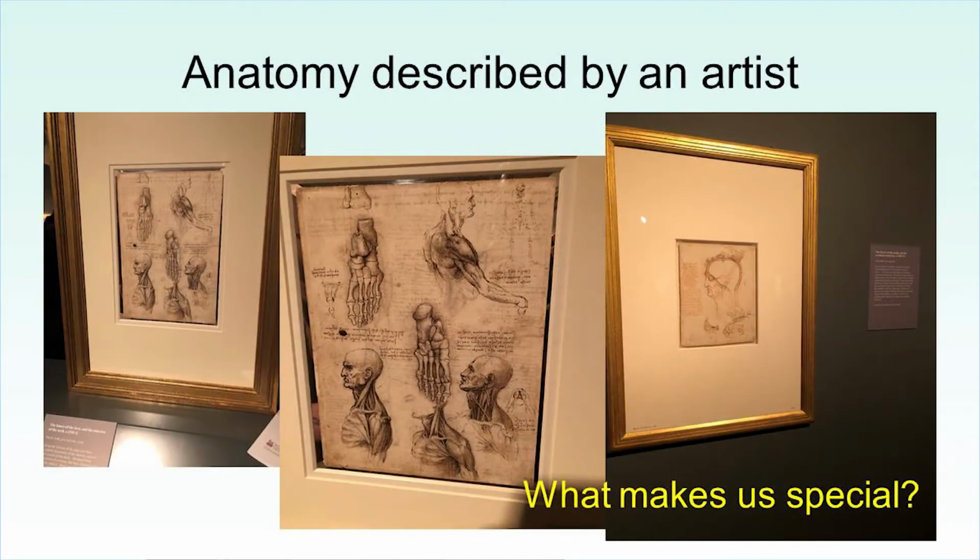The first set of slides are very much based around just a few ideas on the advancements of echocardiography. So these are images which are demonstrating anatomy. Clearly, when you look at these, they are very detailed images. And what makes this special? It's quite amazing the amount of time and effort that has gone into these images demonstrated many, many years ago. How does this impact on some of the work that we go on?